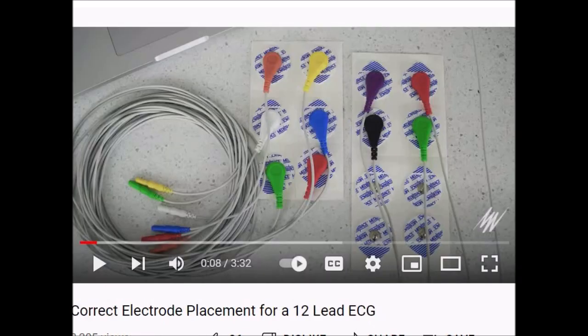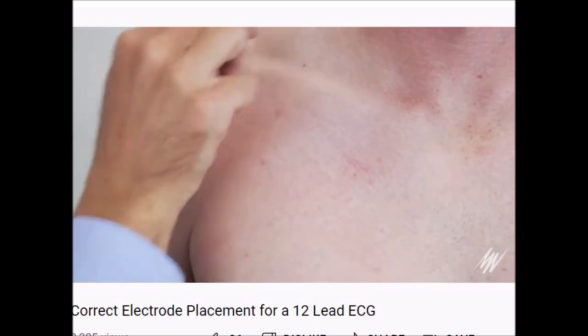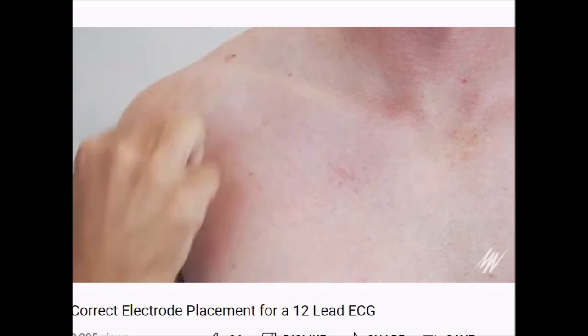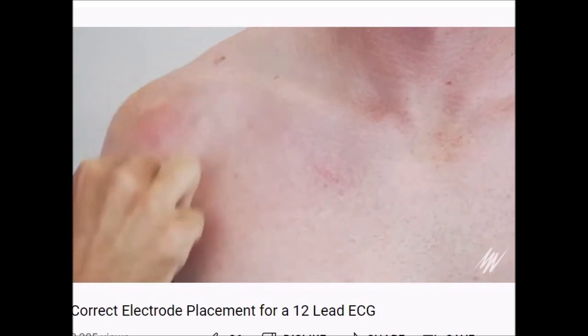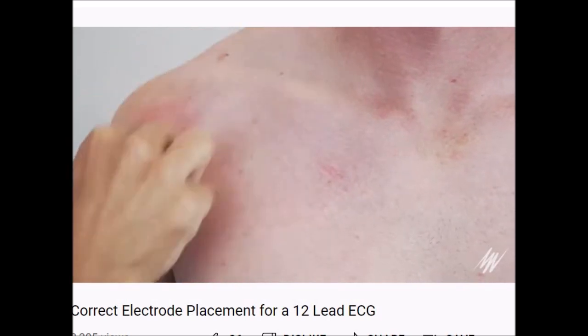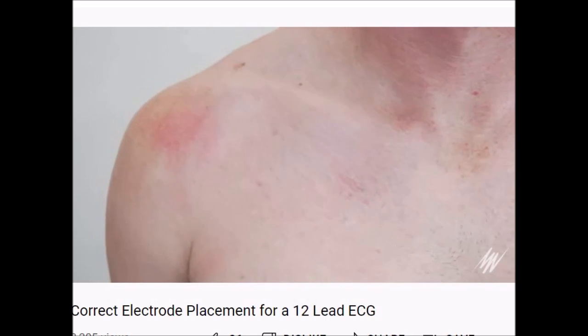And now we are going to look at the experimental setup and clinical techniques. Let us have the concept now. To prep the skin, we use these skin cleansing swabs, which are actually just alcohol swabs. We just wipe down the area really well. This is just to remove any oils which can cause drift in your signal. And now we can place the electrodes.